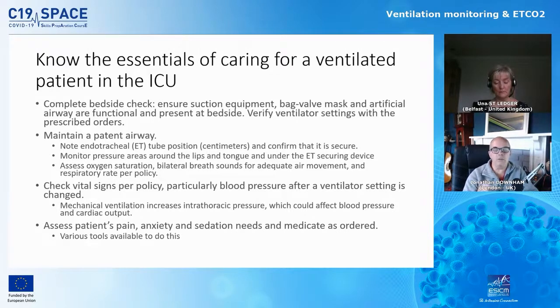And one of the things to note is the blood pressure. Often after the ventilation settings are changed, sometimes the blood pressure can be affected. Mechanical ventilation obviously causes positive pressure in the patient's lungs, and that can sometimes put pressure on the patient's heart, which can cause an issue with their blood pressure.